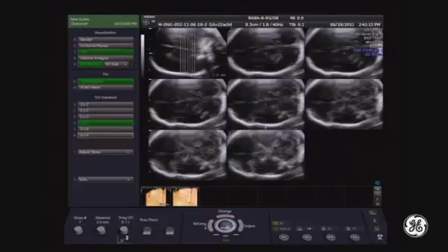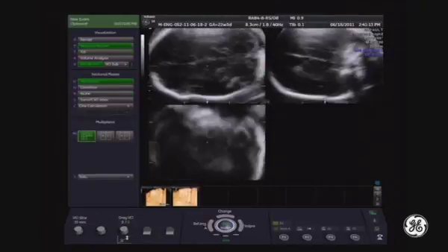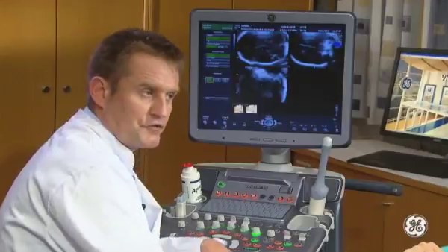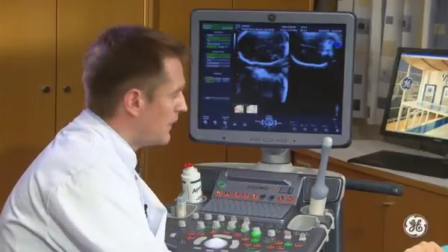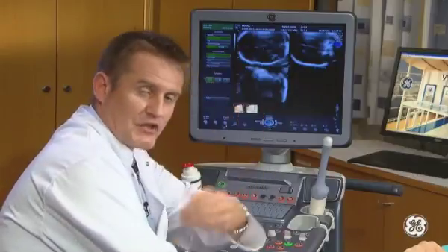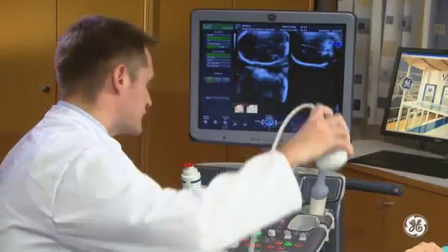Now I will move to the sectional planes, and here I will make the orientation. After I'm orientated, I will try to present the mid-sagittal view of the brain. So let's try to do it.